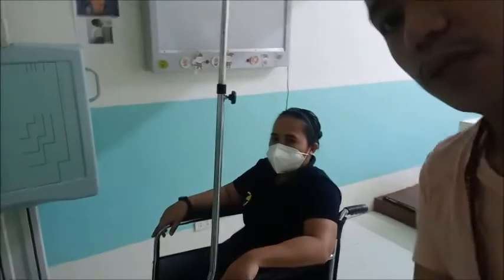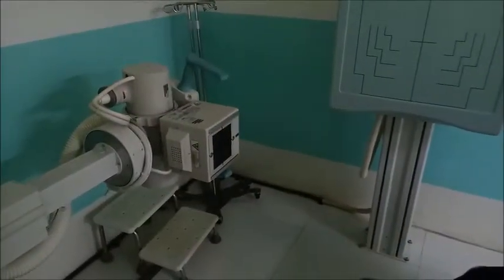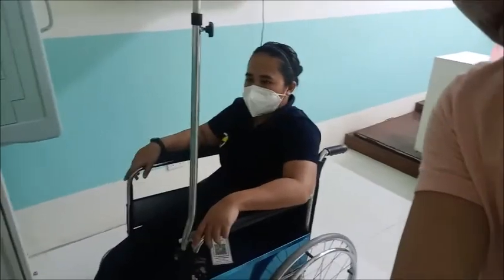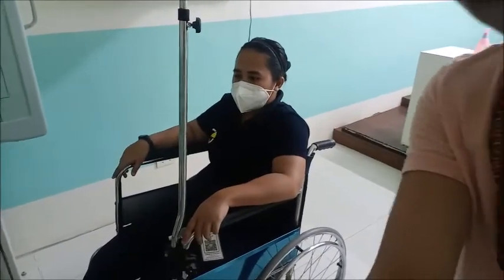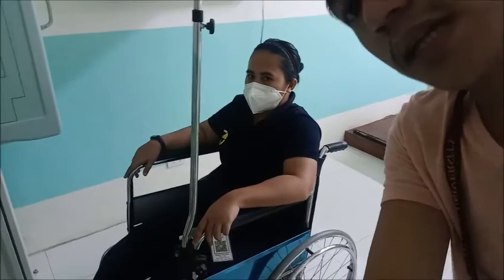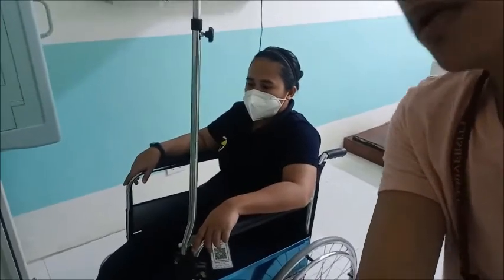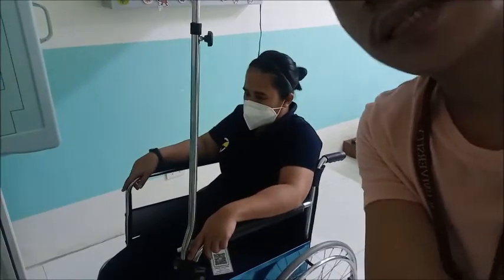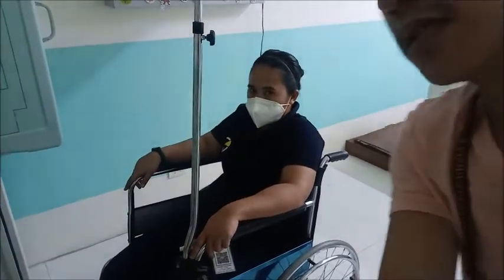Okay, so dili katindog atong patient. So what to do? Modify the position of your tube. We cannot do the PA exam, so do the AP. So parehas naman gihapon na sila examination, parehas na sila images, except that the entrance and exit of the central ray is reversed.